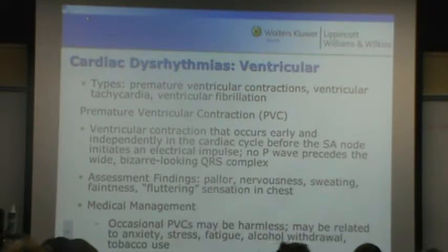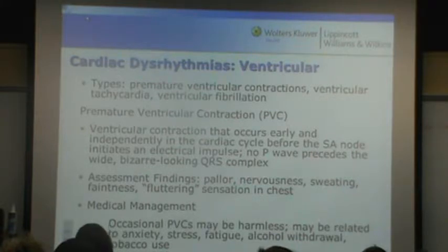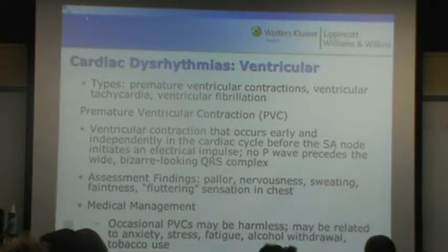We're not talking about the entire rhythm. So I'll take a normal sinus rhythm. This one's not as wide and bizarre looking as I would like. But usually PVCs are pretty benign.